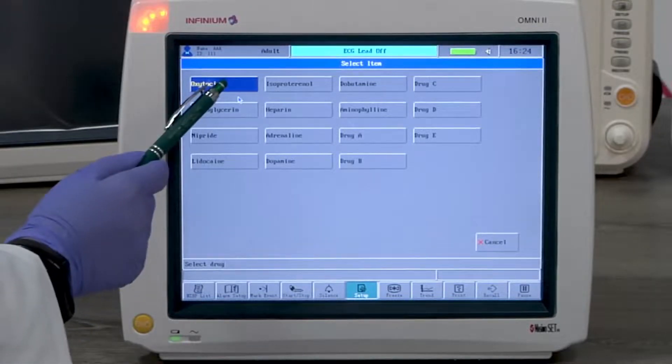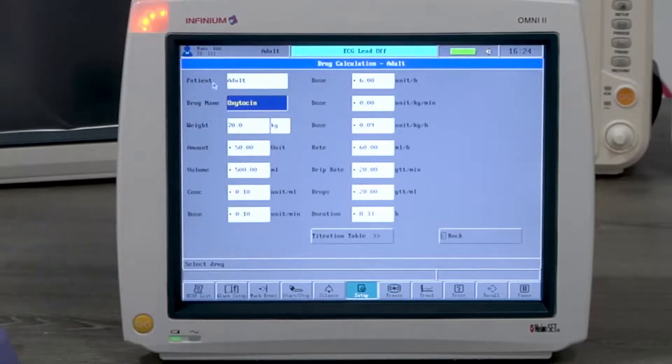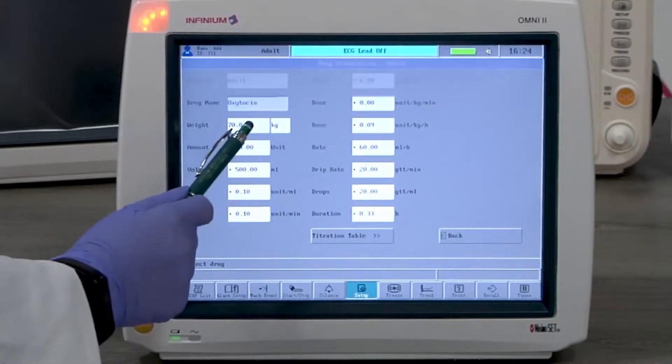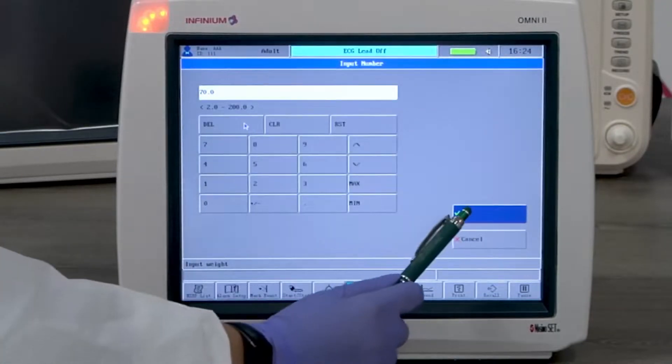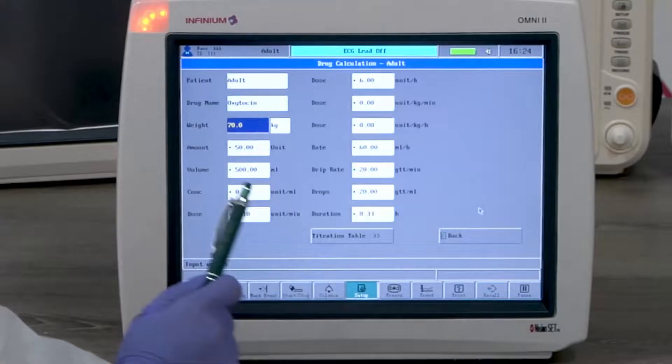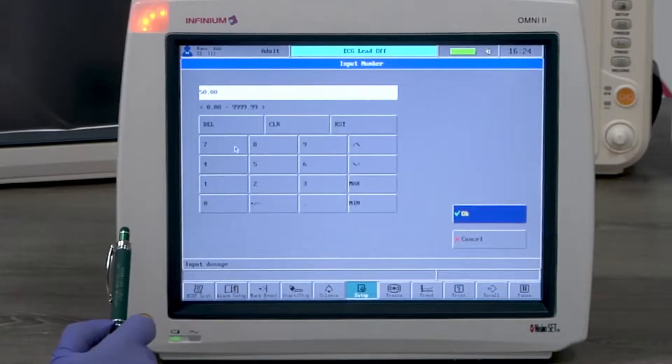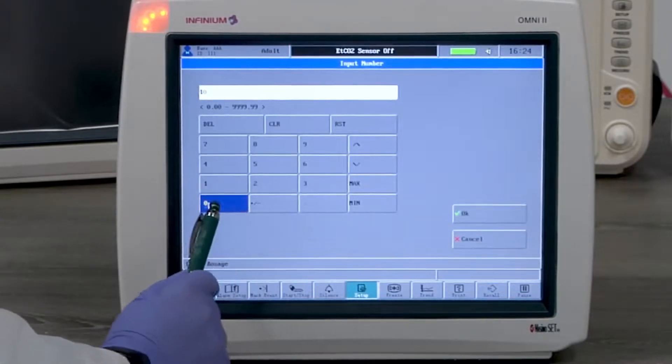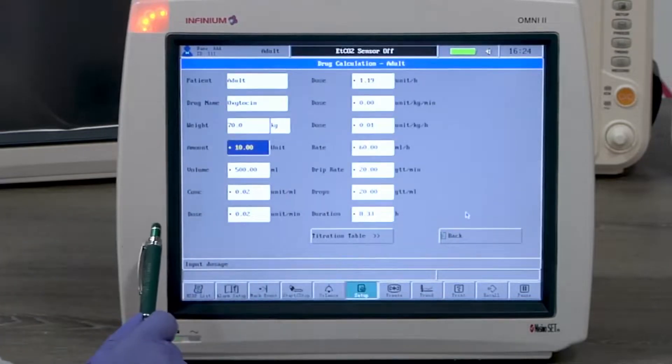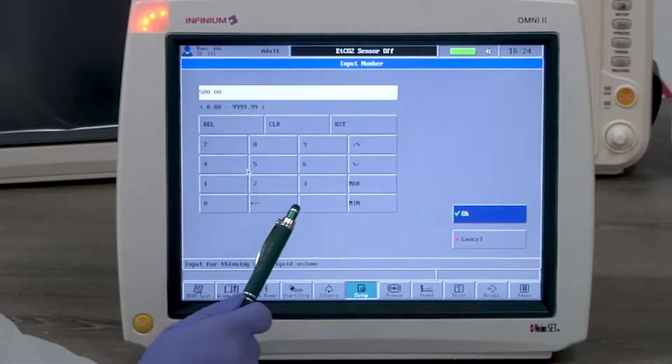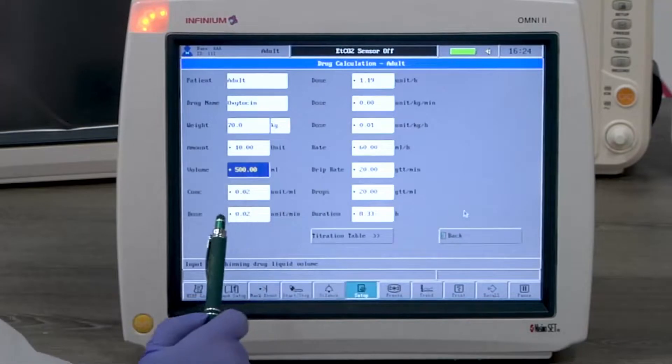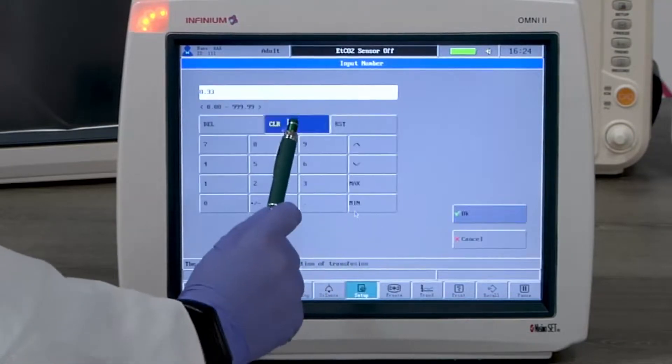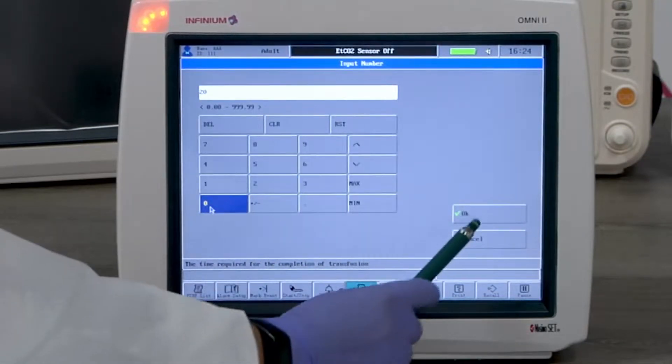Here we'll use oxytocin as an example. Put in the weight. Here we use 70 kilograms as an example. Put in the total amount of the drug needed. We will use 10 units as an example. Put in the volume. Here we'll use 500 milliliters as an example.